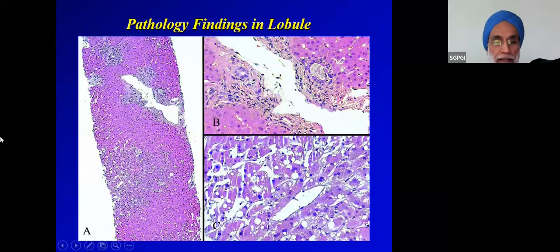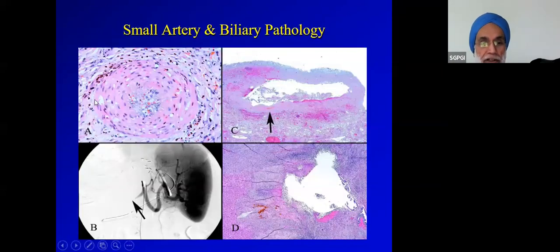And these are the same things. You can also get, if the hepatic artery undergoes severe spasm, changes of even bile duct obstruction-like features with cholestasis. And here's that artery which I showed you. So if there's a severe portal hypertension, damage to the veins, the arteries can go in spasm, and that can cause biliary complications.